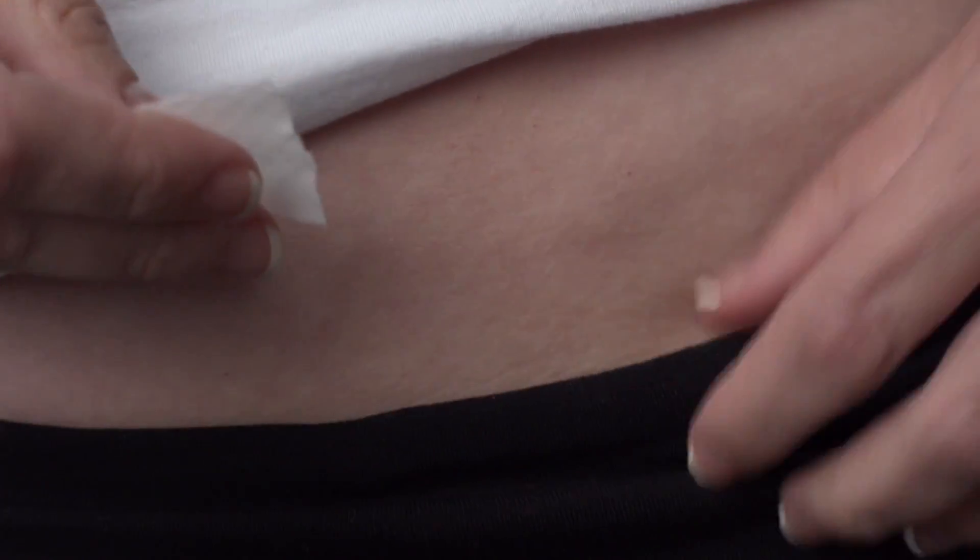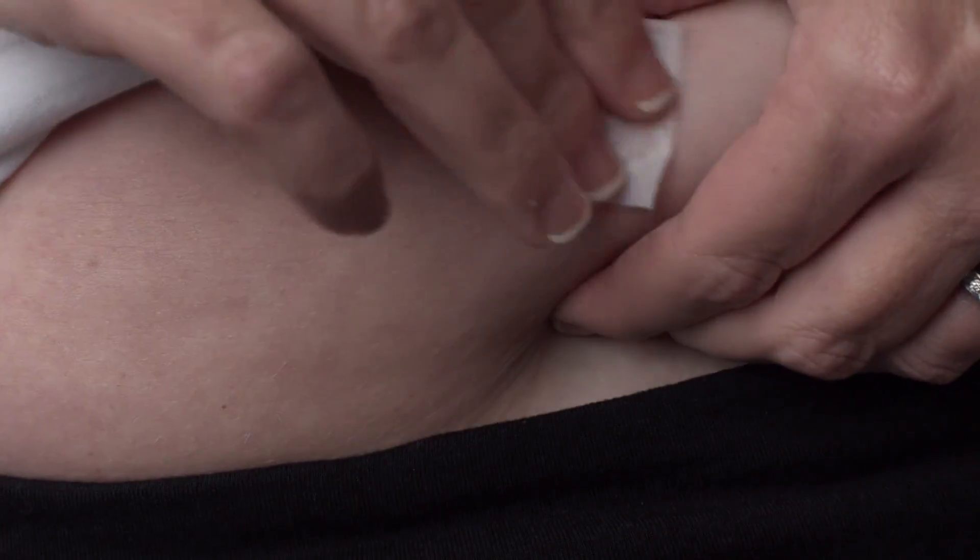Choose an injection site as directed by your healthcare provider. Common sites for subcutaneous injection include the abdomen, top part of the thigh, or back of the arm. For this injection, we will be demonstrating using the abdominal site. Clean the injection site with an alcohol swab and allow it to air dry. You should alternate injection sites each day.